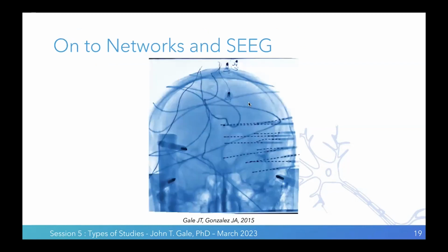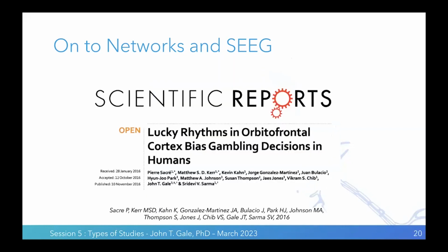So what does SEEG provide? We did these studies doing single units in the OR. And as you can imagine, with one recording at a time, your yield in neurons is quite low. However, SEEG patients are in the EMU. You could run this task a number of times. You could change how the task operates and see how the brain changes with that. But essentially, the beauty of SEEG is we're implanting networks, and we can see how whole networks are functioning during this task. And in fact, we actually ran the same behavioral task in our SEEG patients.